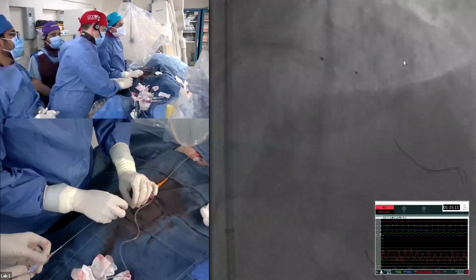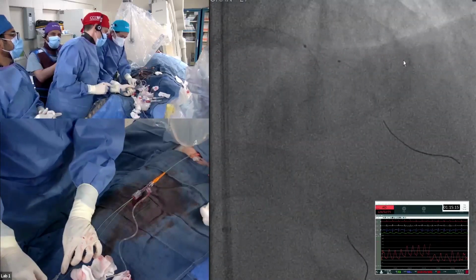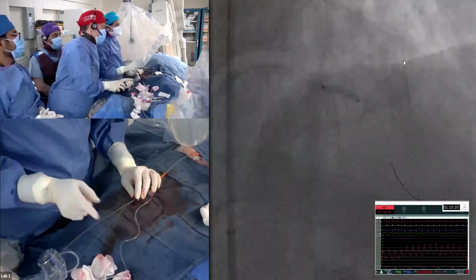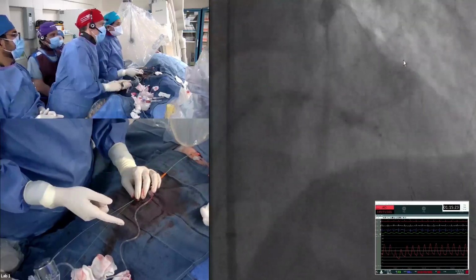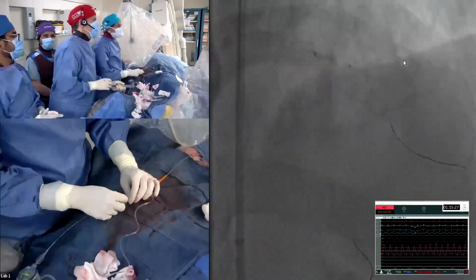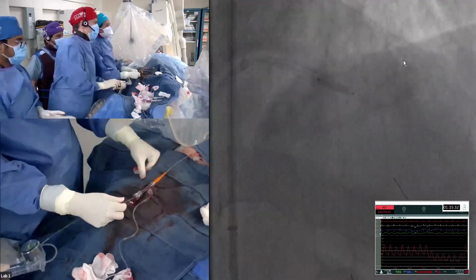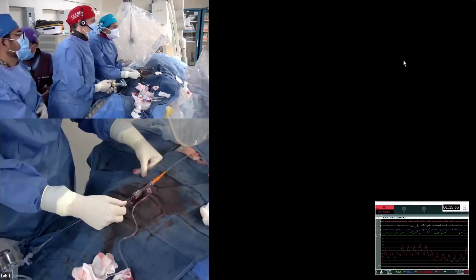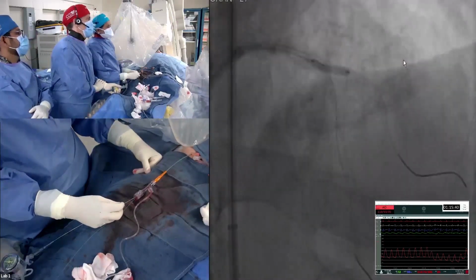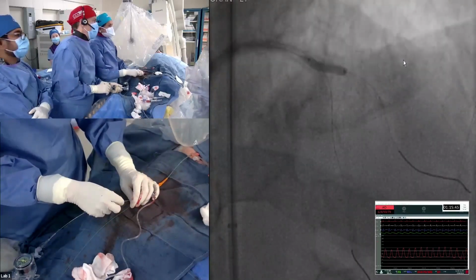I know, I know. But I think our goal is, I'll tell you what, we always decided that we want to go through all the steps to teach our audience rather than just show and tell. So step by step, and in this particular case, a lot of step points. Now, once it is open nicely, you see the good angiogram, we are ready there. So this pressure, we are going 22. Okay, and also look at the cine. Nice expansion. What size is the balloon? Is it 2.5 balloon? Yes, 2.5. Looks like good expansion.